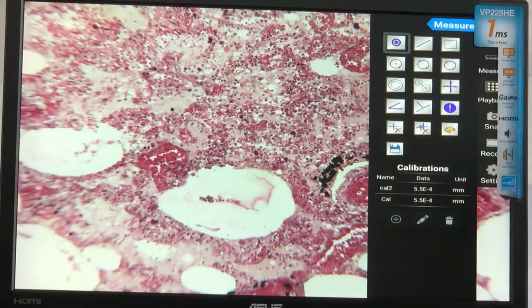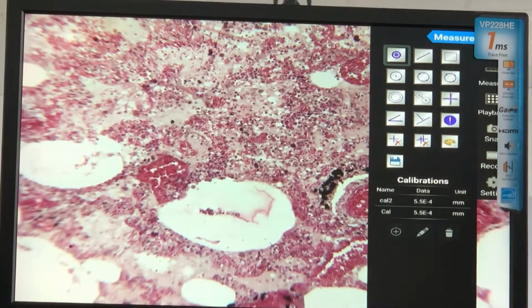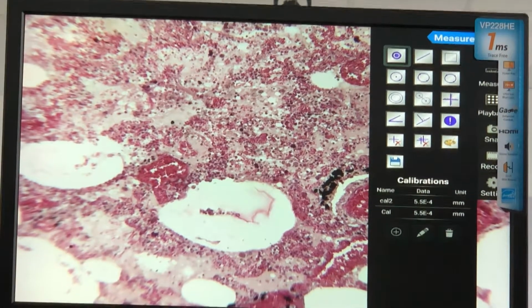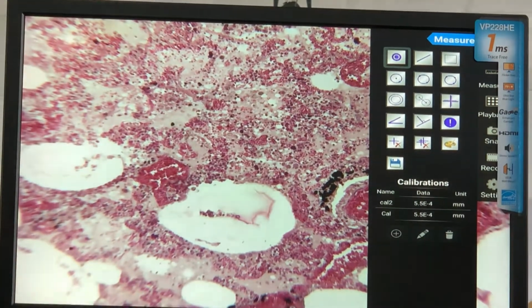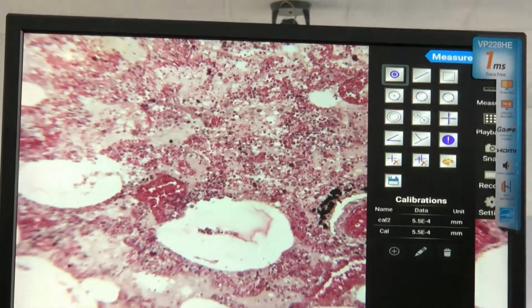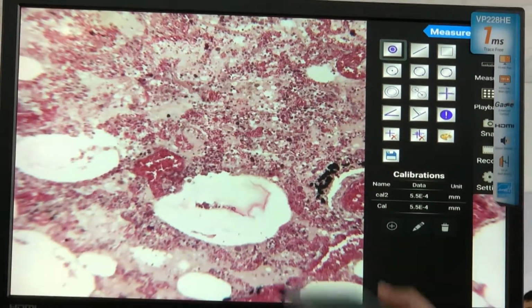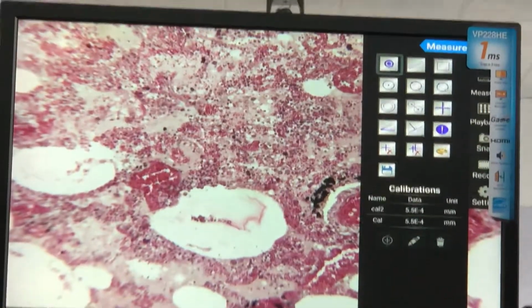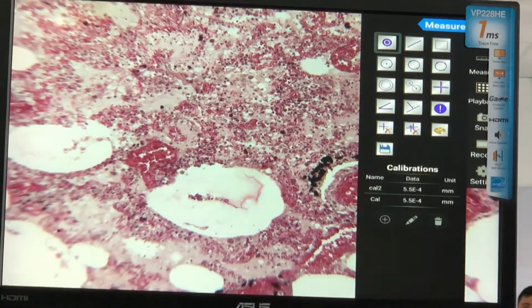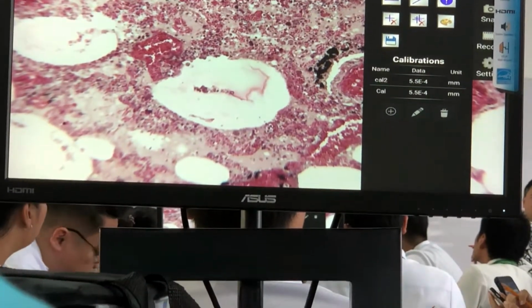So, how do you make this a 5-second analysis of your diagnosis? First, you have the extravasated RBC within the alveolar space. So what are extravasated RBC? What is the color of RBC in an H and E stain? Pink. Red blood cell, the name itself is red blood cell, so it's red, automatically pink. Unless you have a stain that is not so well stained, you will see a pink that is ovalized or not well stained. But the red blood cells are red.